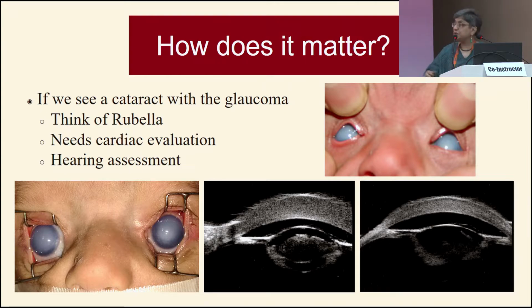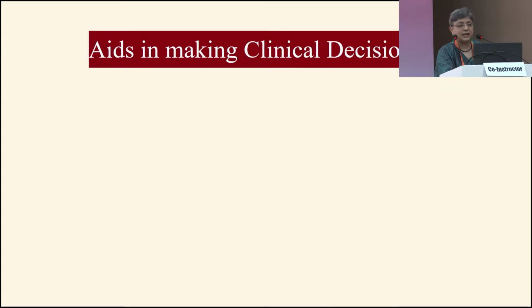So this, of course, was the UBM which taught us this, and it's the UBM which taught us that so many of them could have cataract. The other condition, of course, would be oculocerebral syndrome of Lowe, but that's completely different. You have sunken eyes, you know, the picture of a Lowe syndrome would be completely different, but rubella in our country with non-universal vaccination is a reality.